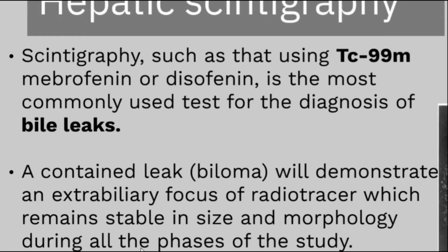So they inject the radiotracer, not the contrast, and they will wait. If the radioactive substance is seen collecting in a specific site in the liver, then this is a bile leak. If not, there is no bile leak. Yes.